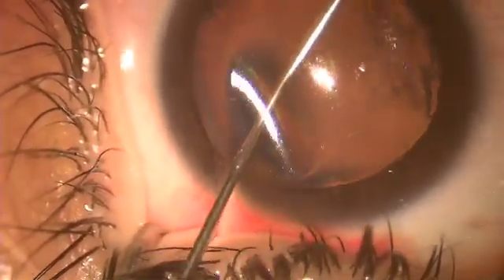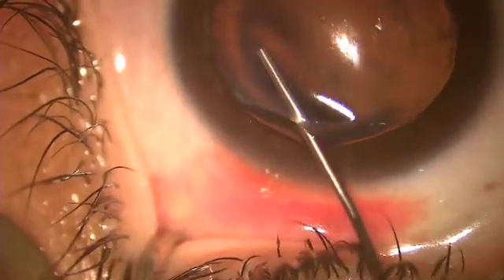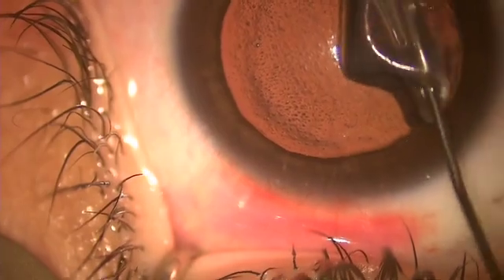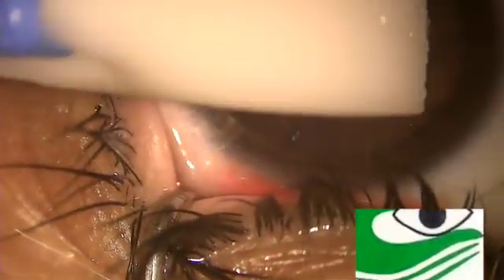Go into it, polish, raise, polish, raise. Here we have taken a room temperature and a warm BSS, not more than 35-40 degrees, otherwise you will burn the stroma, but avoid cold BSS. Normally what happens is you have cold BSS with us for the cataract surgeries and all what you're doing.